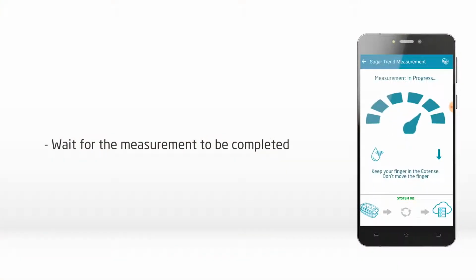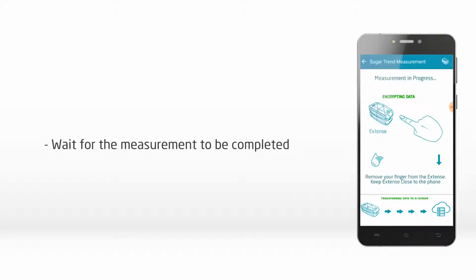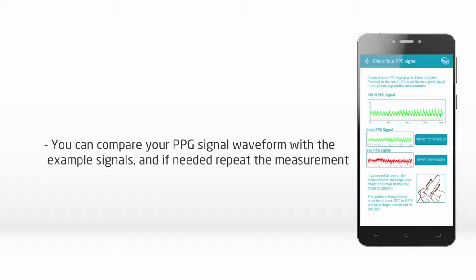Wait for the measurement to be completed. Wait for completion of the measurement and for the data to upload into the cloud. You can compare your PPG signal waveform with the example signals and, if needed, repeat the measurement.